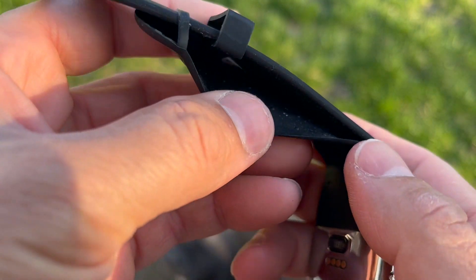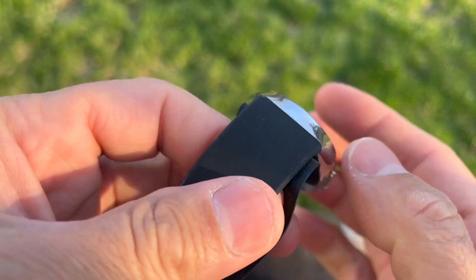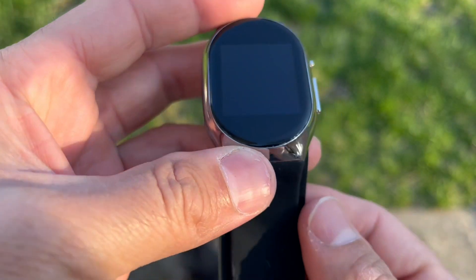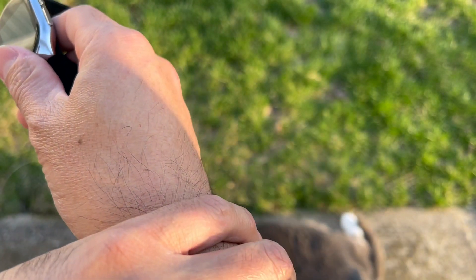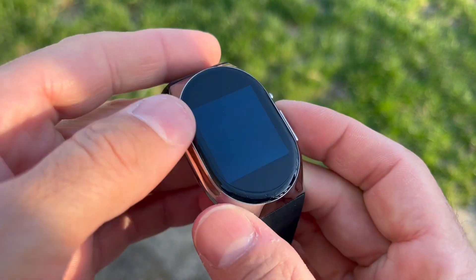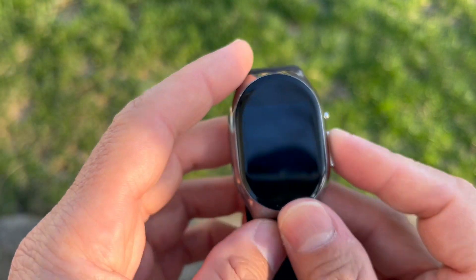This watch has an inflatable cuff right here — it actually inflates and takes your blood pressure. I've tested it against my wife's medical wrist blood pressure machine and it's been very accurate. If you have high blood pressure or are concerned about your blood pressure, I highly recommend this watch. Let's jump into the app and I'll show you what I've done with it so far.